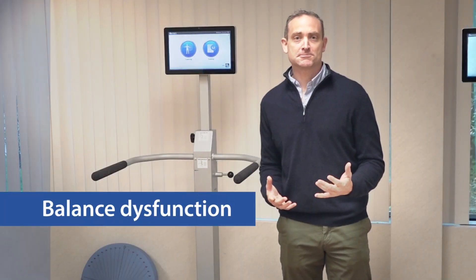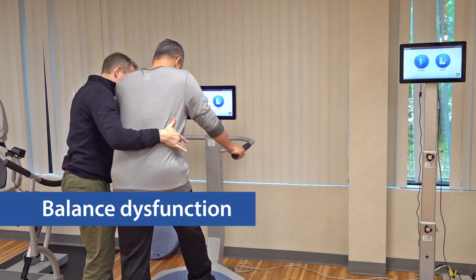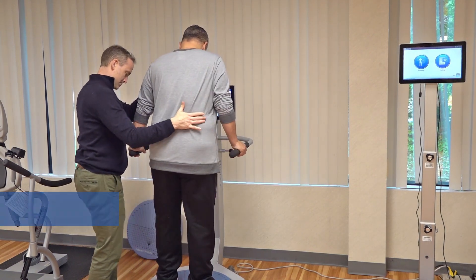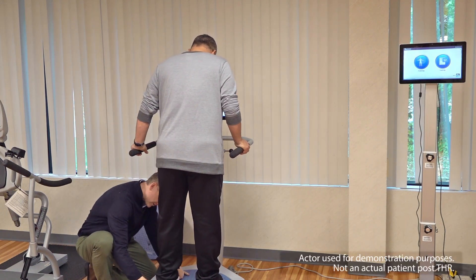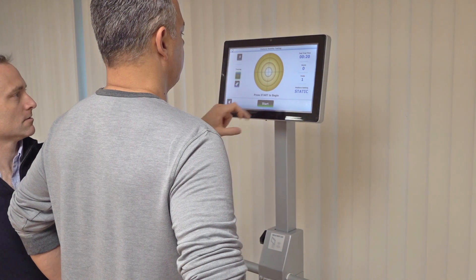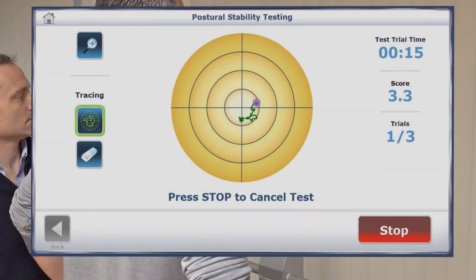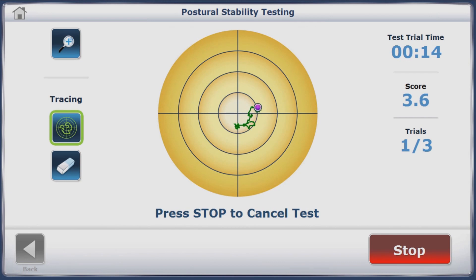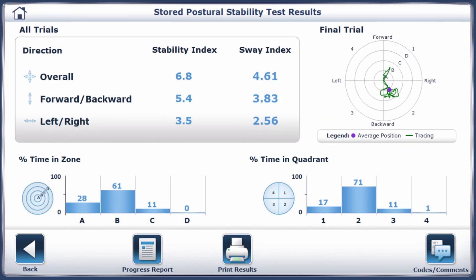After a total hip replacement, patients might present with balance issues. They have limited movement in their involved limb due to fear and pain. Poor proprioception is another common impairment that can affect the total hip patient's balance. To help patients become more functional, we can improve movement through sensory motor activities. You can use a postural stability test and percent weight bearing mode on the balance system SD. You can see the patient's improvement by observing the on-screen tracing or by reviewing their values in the test report.